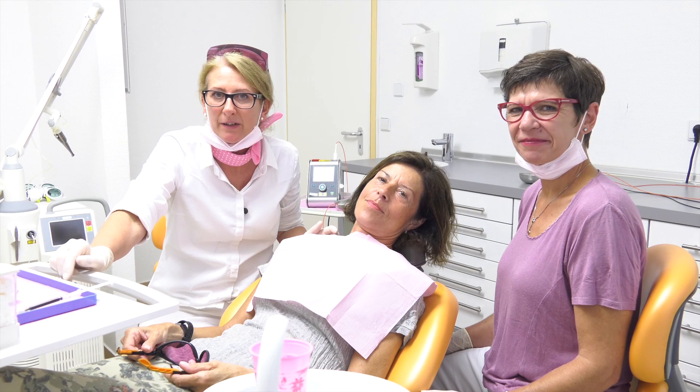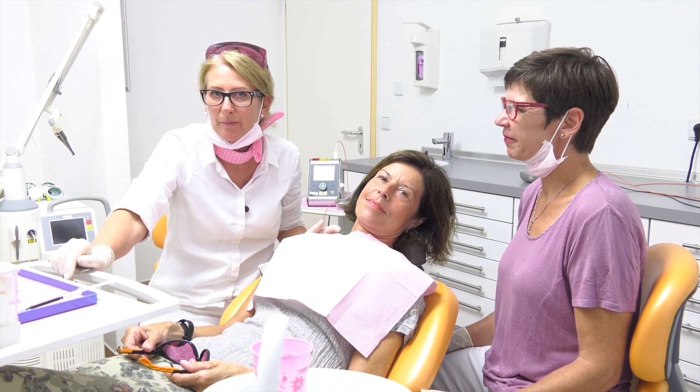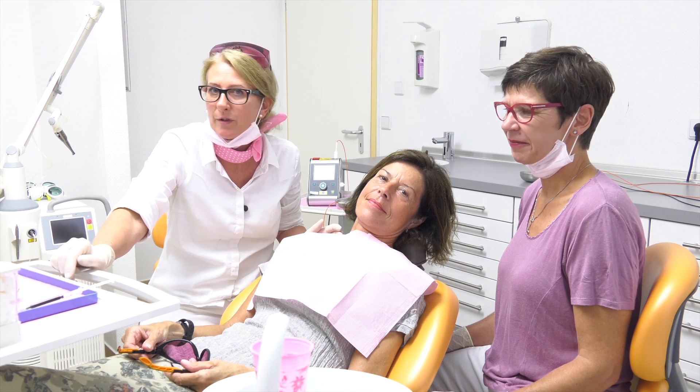Hello everybody, it's me, Janet, again. The summer holidays are over, we are back again and I'm very glad about it. Today I will show you the treatment of periodontitis. Therefore we will use the diode laser and a special kind of dye. Periodontitis is a bacterial disease and I want to show you some pictures before we start with the treatment.